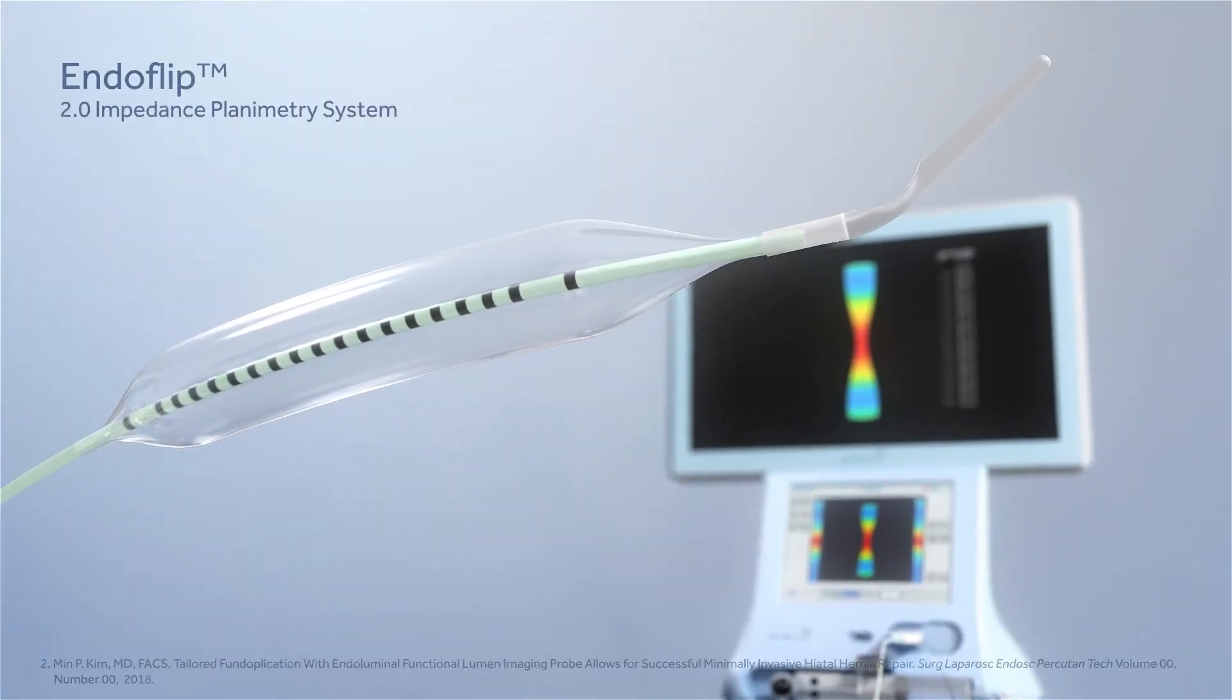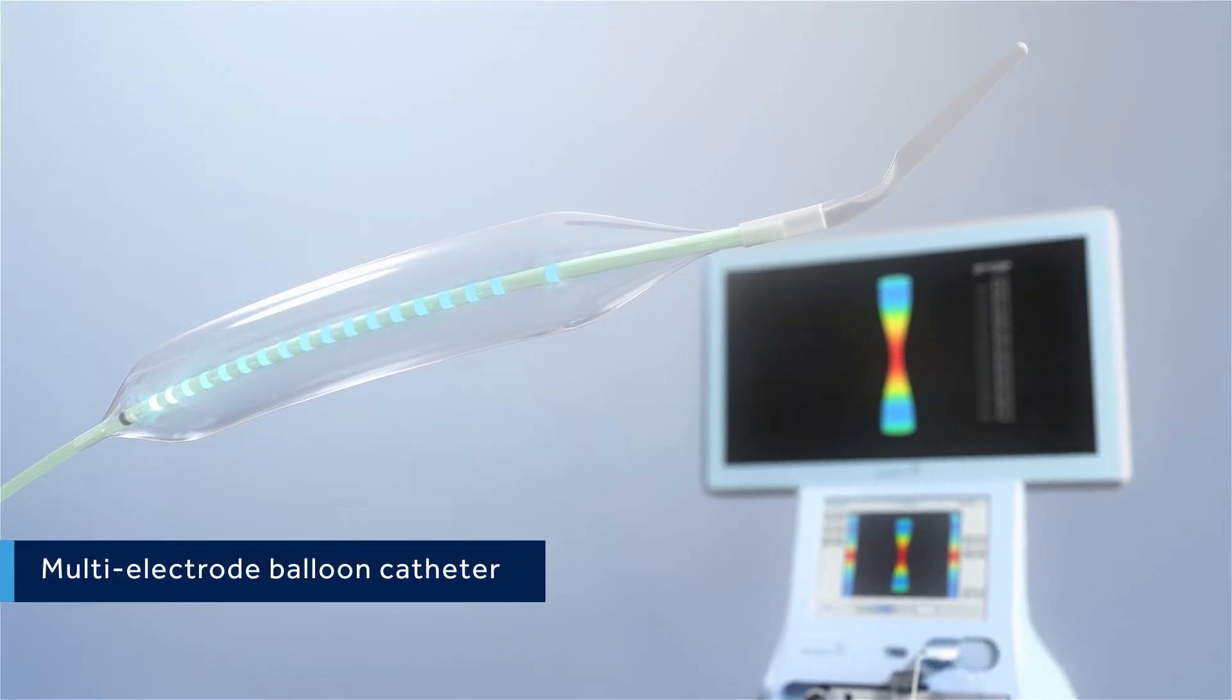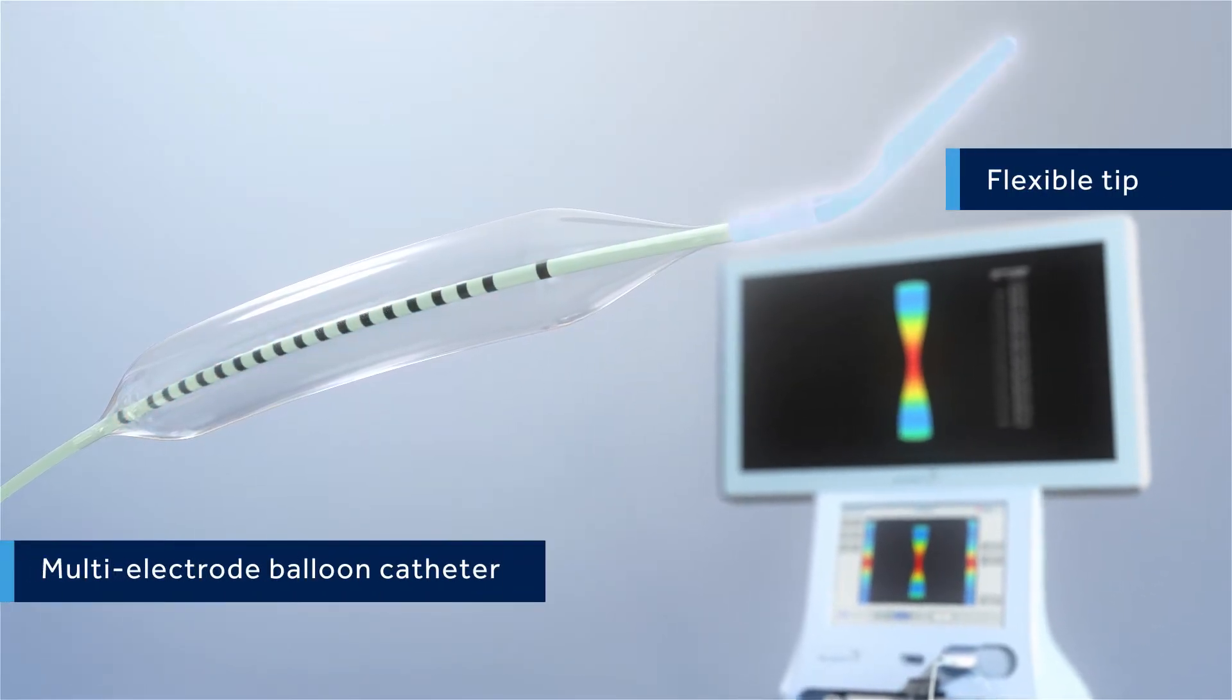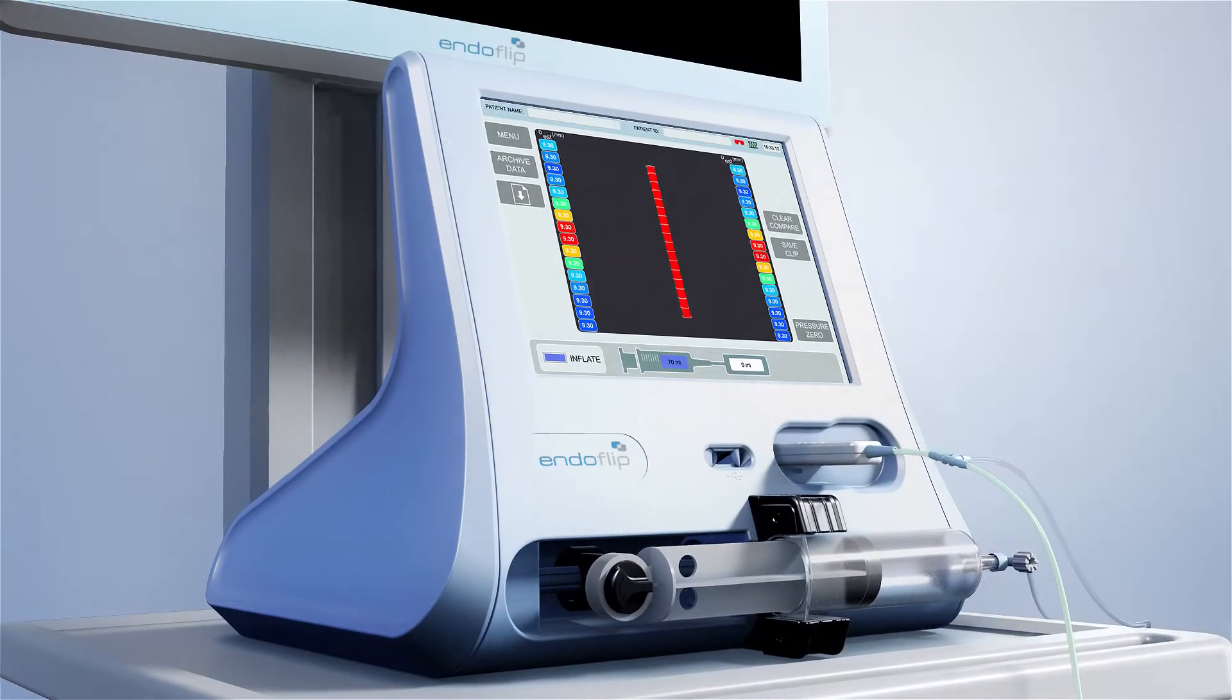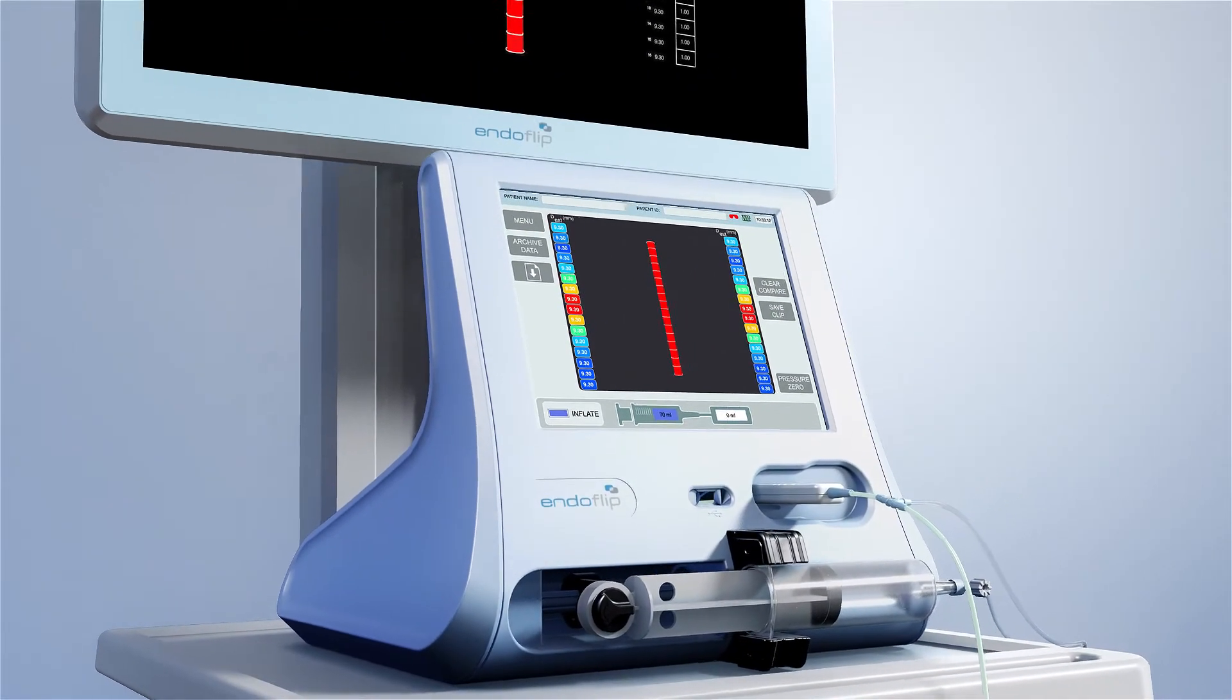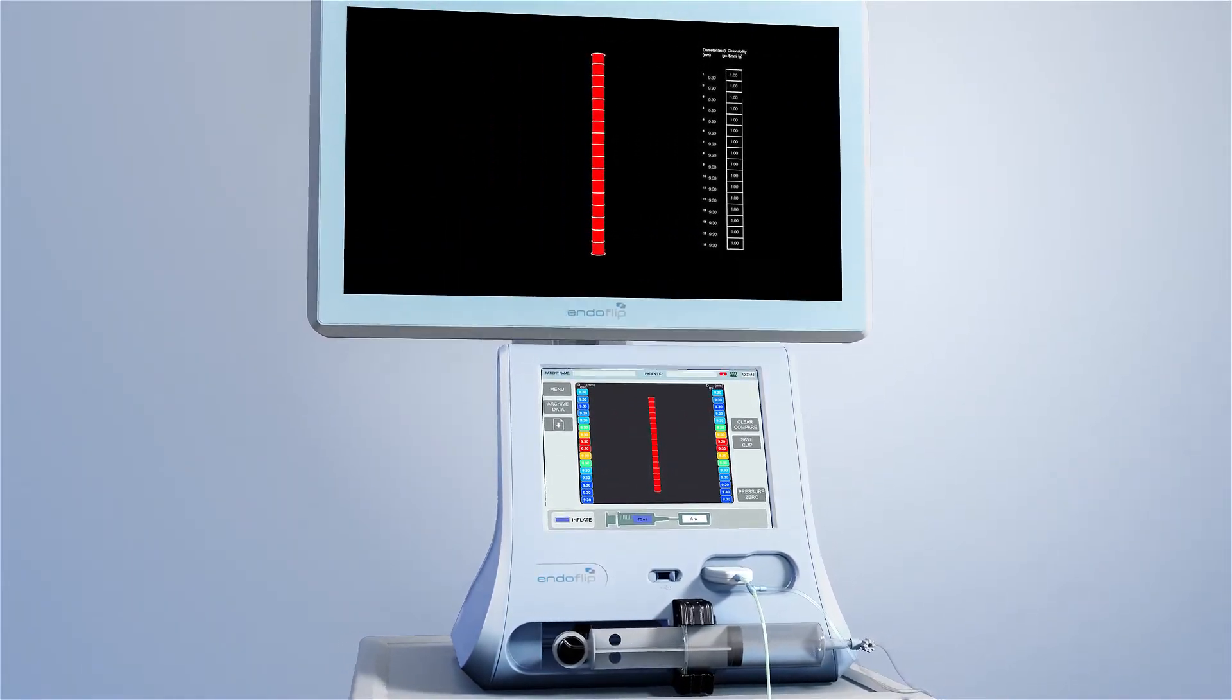The EndoFLIP 2.0 impedance planimetry system includes a multi-electrode balloon catheter with a flexible tip that acts as a functional lumen imaging probe. The system also introduces imaging software that displays esophageal topography output and dimensional changes on a 24-inch touchscreen.